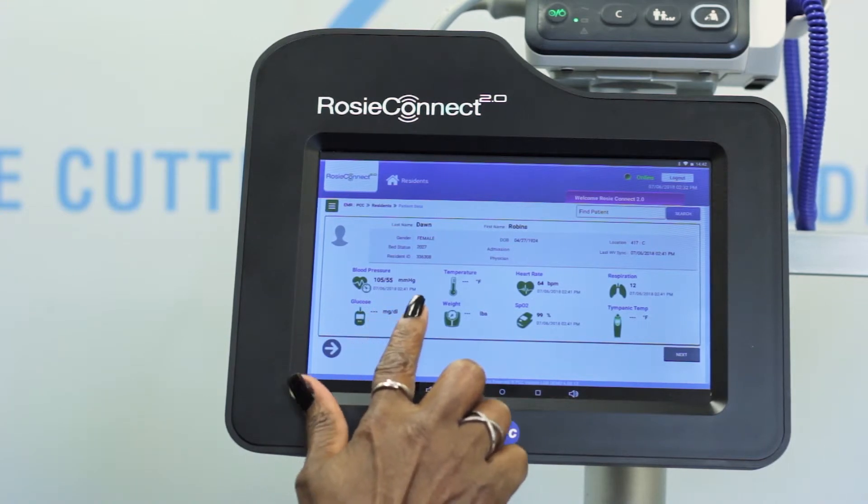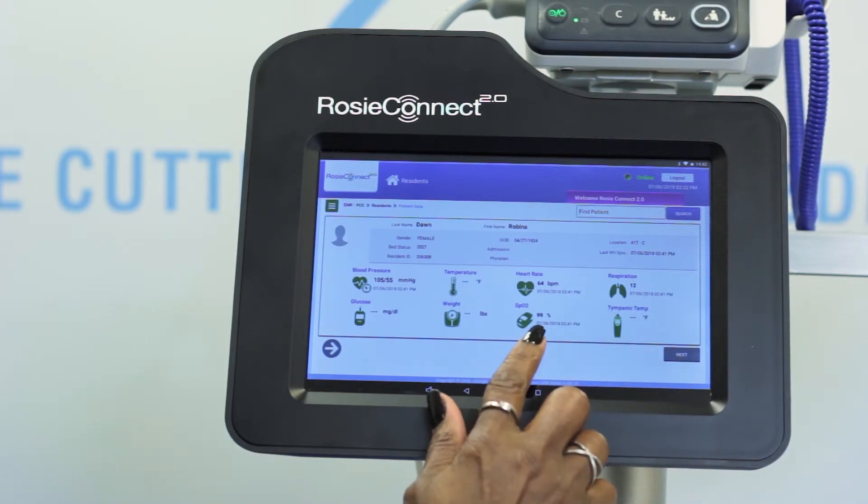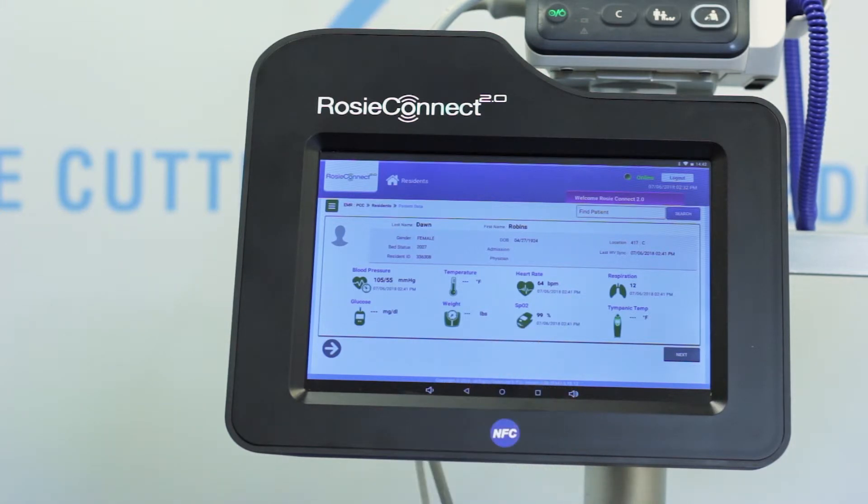That's it for now for my resident's vitals data. Thank you, Dawn. Remember, when moving from one resident to the next, you must press C on the vitals monitor to clear the data before moving to the next resident. Before we pause to let you take a resident's vitals, I want to show you a couple of features of the resident's patient data page — it will show you the date and time stamps of any of the latest vitals taken and recorded in the EHR. This is so helpful because it gives you something to reference when taking the next set of vitals. Now let's pause here so that you can take your resident's vitals and save them.